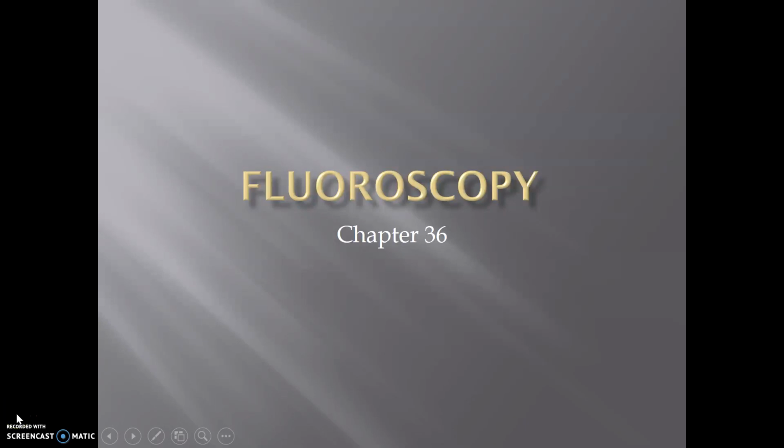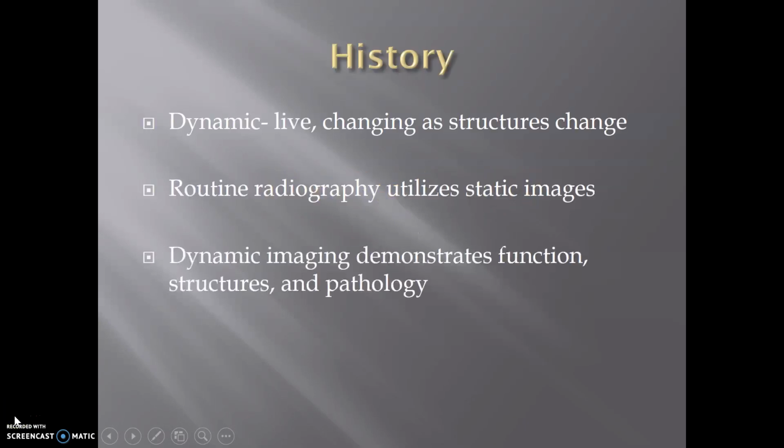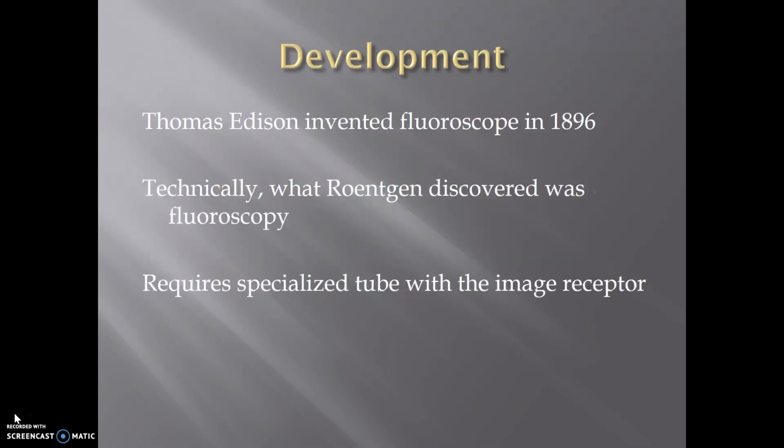Today's lecture will cover fluoroscopy. Fluoroscopy provides dynamic, live, changing images as structures change. Routine radiography utilizes static or unchanging images. Dynamic imaging demonstrates function, structures, and pathology.